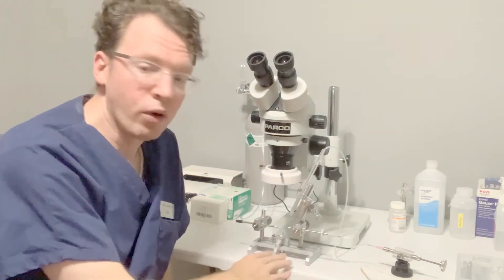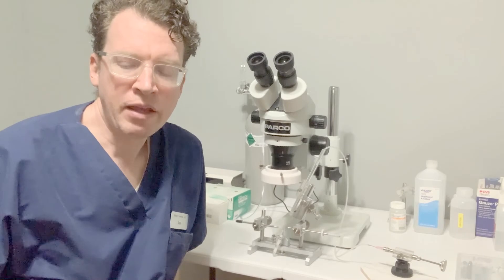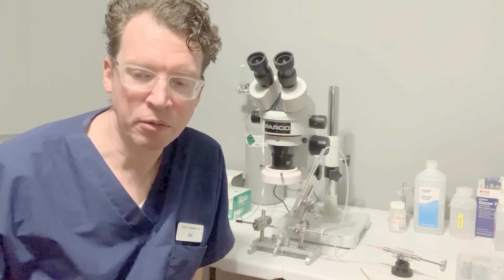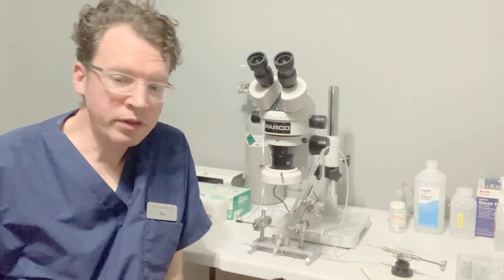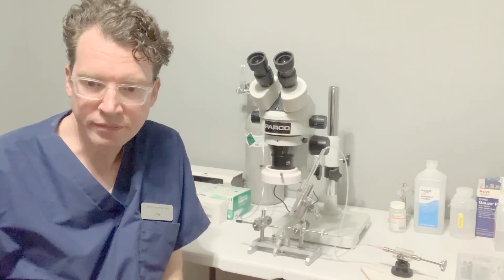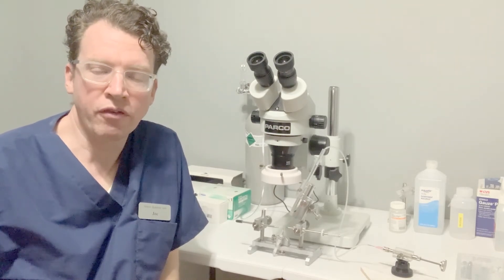Make sure you have an adequate work surface for your equipment. I made the mistake of using a plastic folding table to work on. Unfortunately, the weight of the equipment is causing the table to deflect. The base of the microscope is especially heavy to provide stability, and I will need to upgrade my work surface. So don't be like me — make sure you have a solid work surface from the get-go.